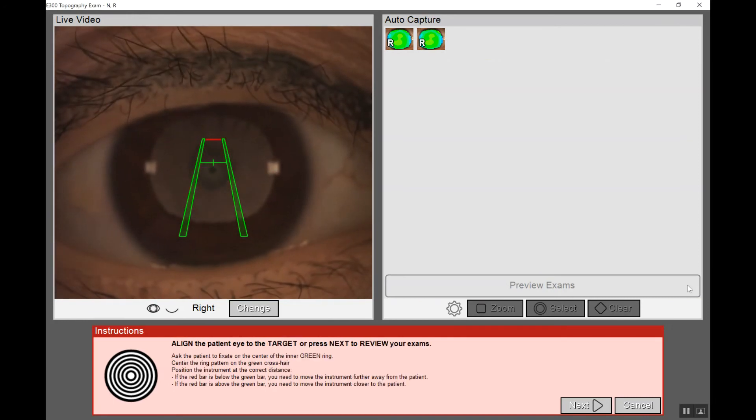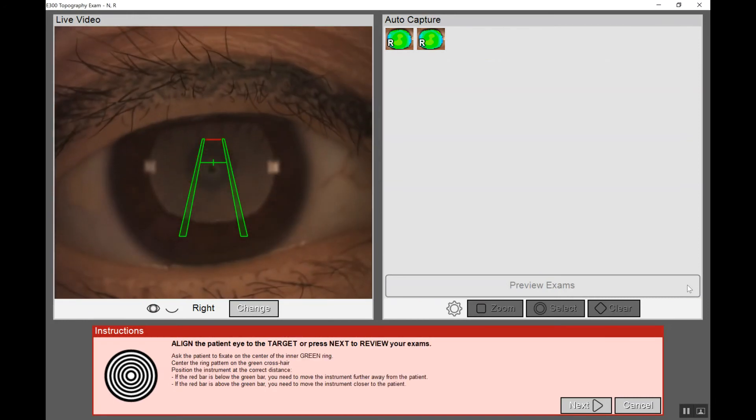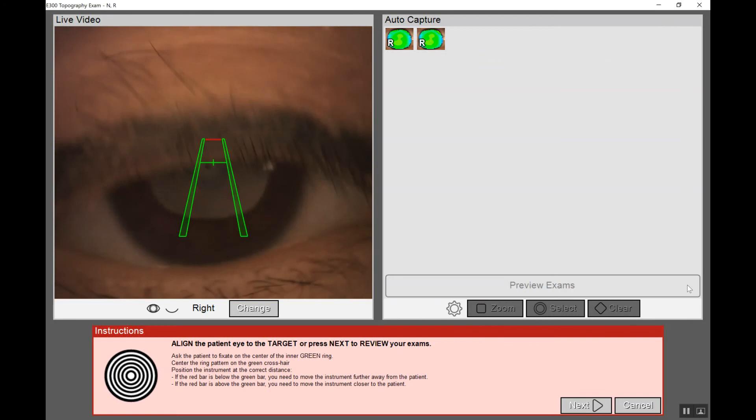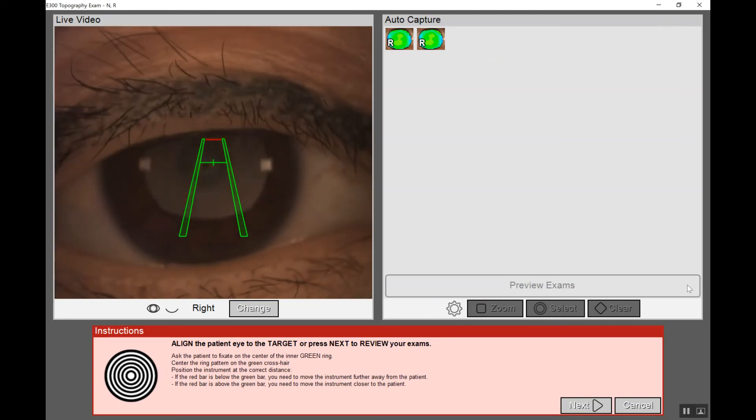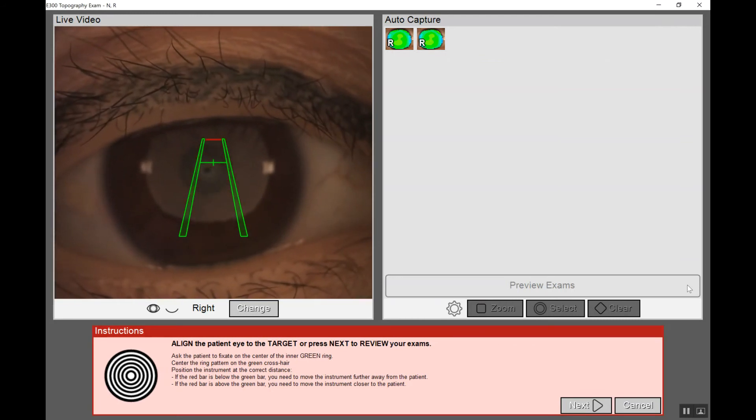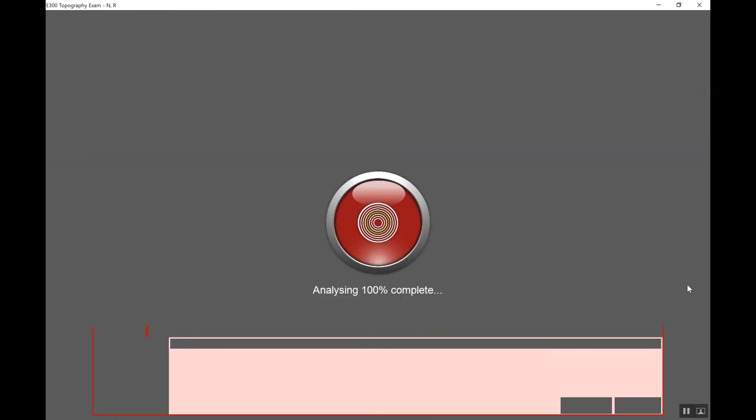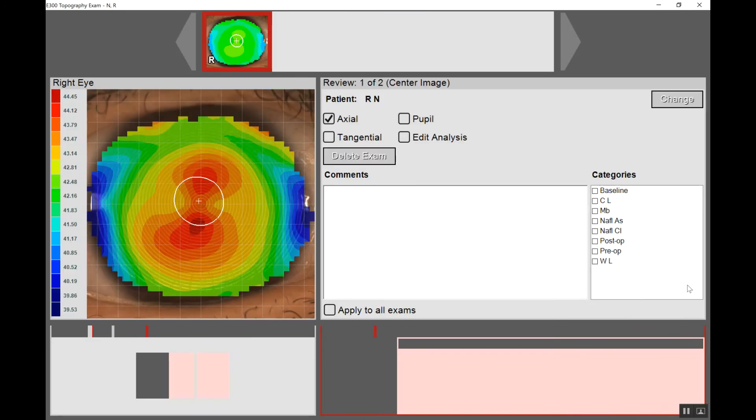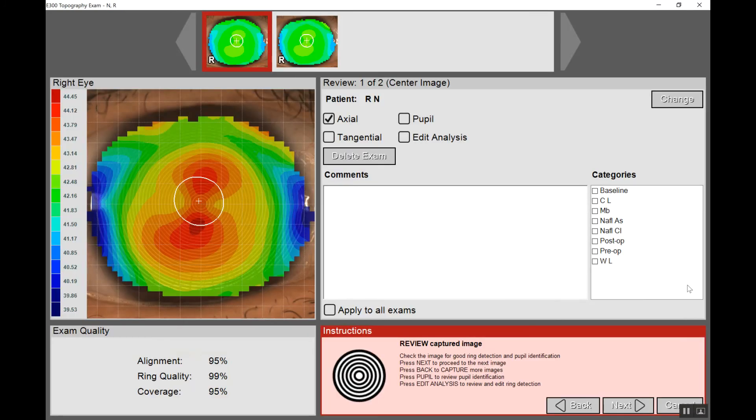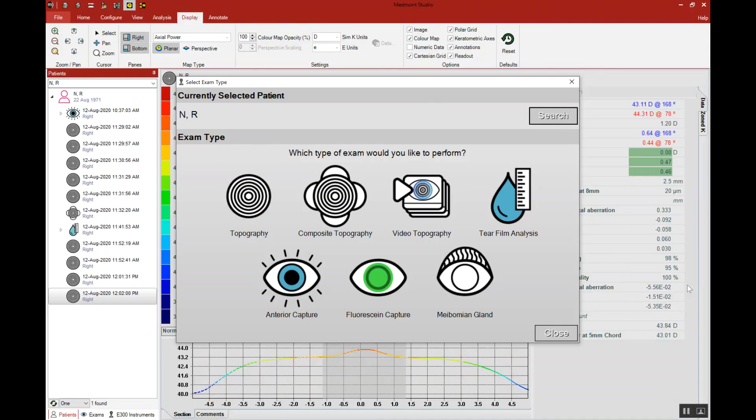And now we can choose to go over to the left eye and take additional images there or finish by clicking the right button. It will allow us to review, add any comments to this window, or we can click next and finish to save those topographies into the patient file.